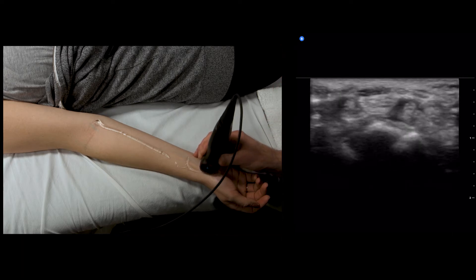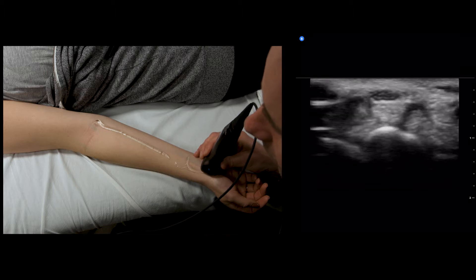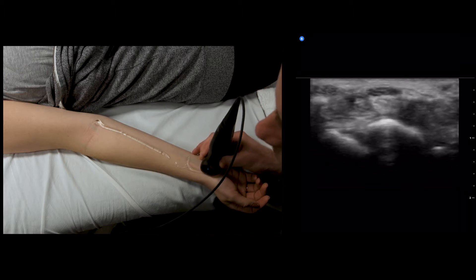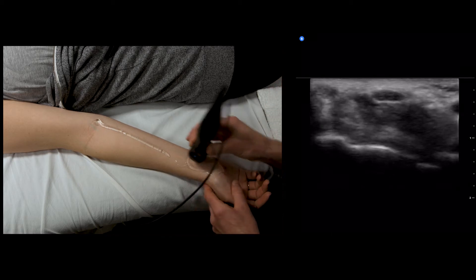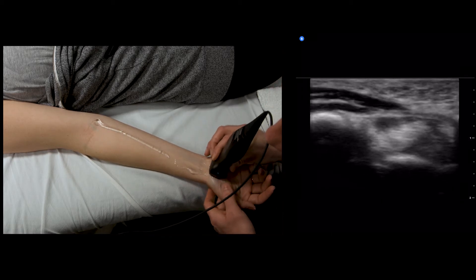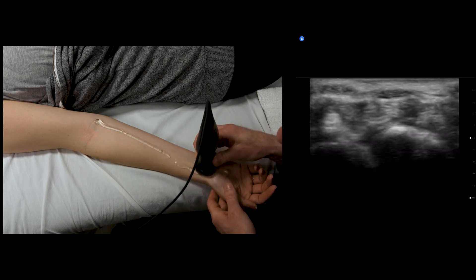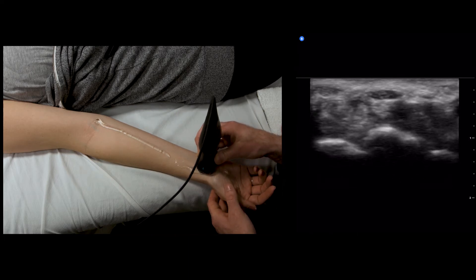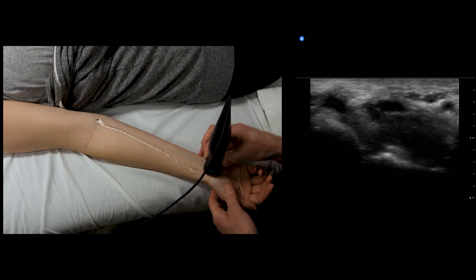The median nerve is the hypoechoic fascicular structure in the middle of the screen here. We're going to follow it down into the carpal tunnel and make sure we've got enough gel. Here's our median nerve. We're going to run down. The median nerve is going to drop down.